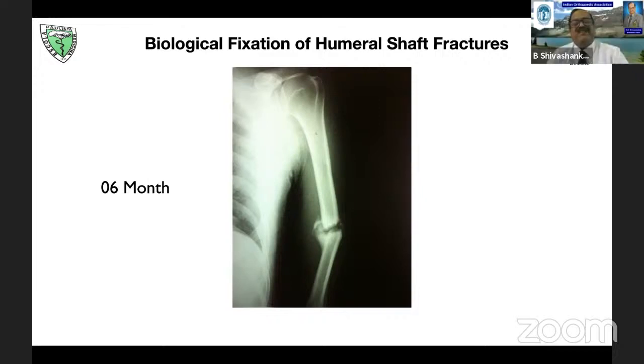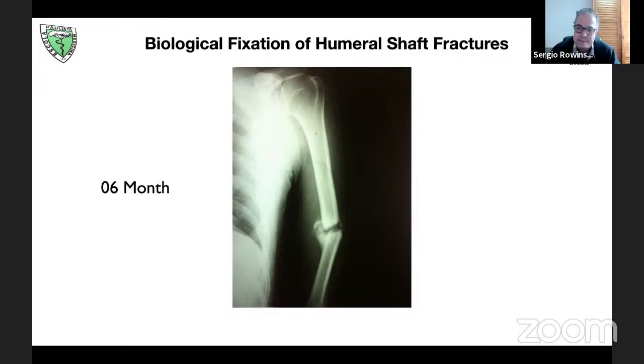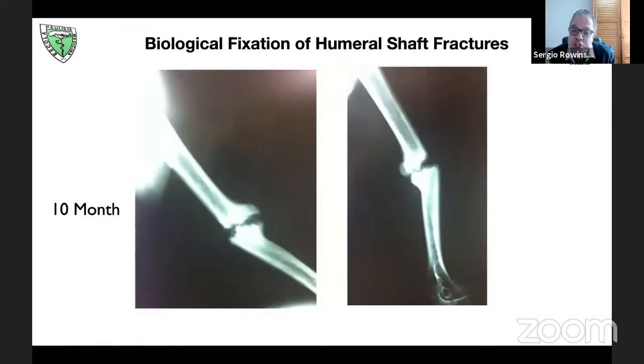6 months, there is no union. I don't think now it will unite. Yes. Okay. Diego, and what about now? What to do, Diego? I wouldn't decide only with the X-ray. I think the patient's symptoms at this time of the evolution are important, because if it's in the way of healing, he will tell you before the X-ray. Sure. How is the patient from a clinical point of view, Coco?